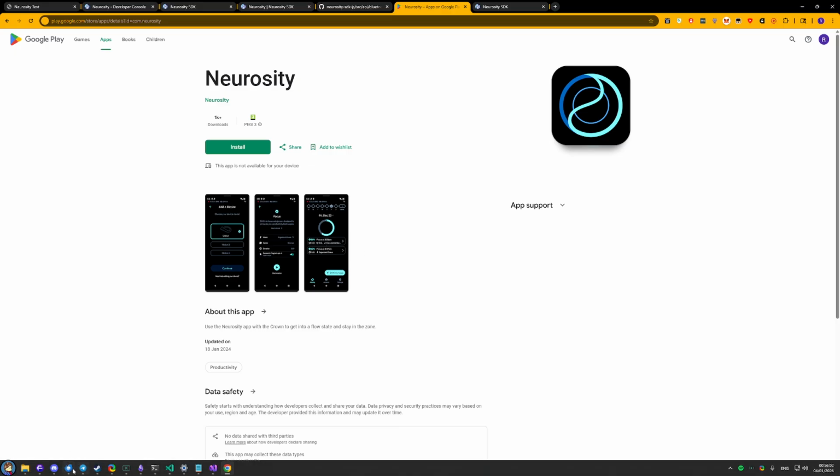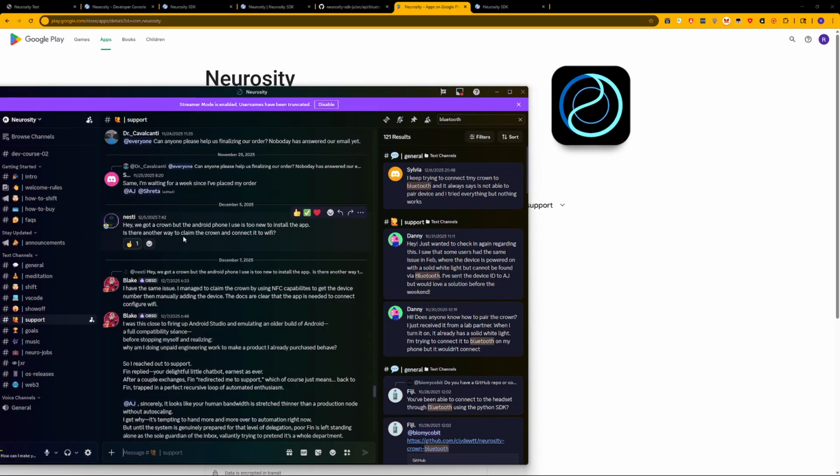So if we take a look at the support channel for Neurosity, you'll see, hey, we got a crown, but the Android phone I use is too new to install the app. Exactly my problem. Is there a way to claim the crown and connect it to Wi-Fi? I have the same issues. I managed to claim the crown by using NFC capabilities to get the device number, then manually adding the device. The docs are clear that the app is needed to configure Wi-Fi. This is incorrect. I have fixed it.